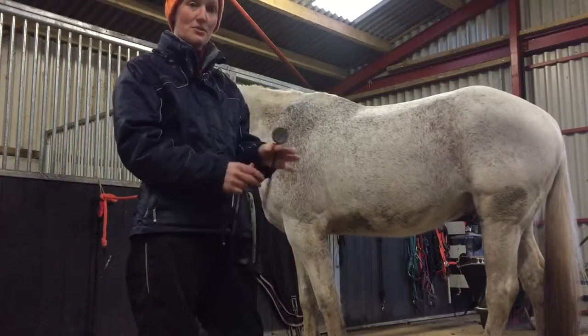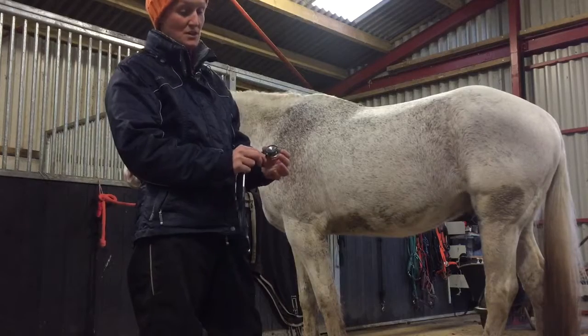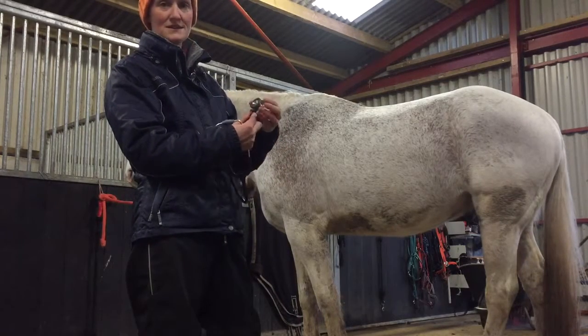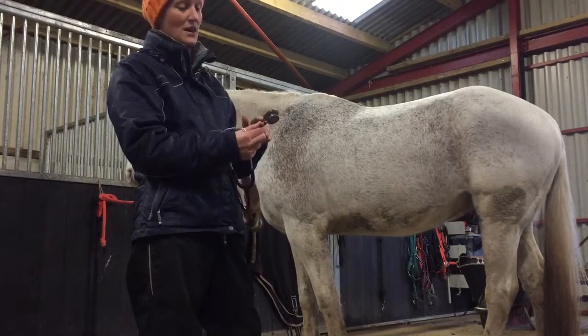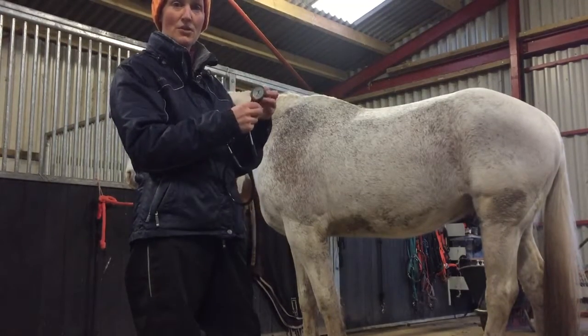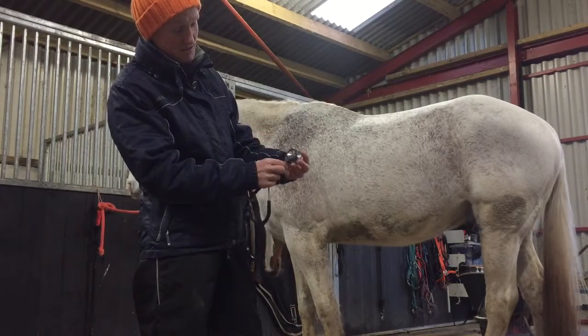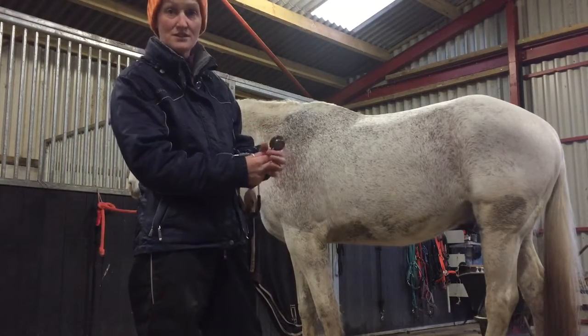The next thing to look at is the drum of the stethoscope. This particular one has a twist collar, so when you turn it round you can use the drum on one side or the other. For a horse we're going to use the big drum, so we need to make sure that the little hole is pointing in the right direction so that we get a good sound.